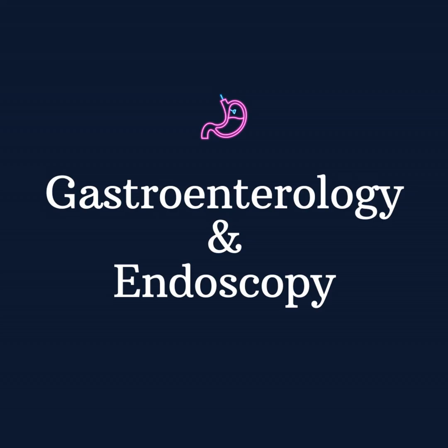There are various approaches to resecting flat lesions. While some experts prefer the cold snare technique, others opt for hot snare. Our preference is endoscopic resection using interventional chromoendoscopy. This method is chosen because the LST has an irregular, almost triangular shape, is located between folds, and we aim for an R0 resection, which means removing the tumor entirely without burning or ablating the edges incompletely.